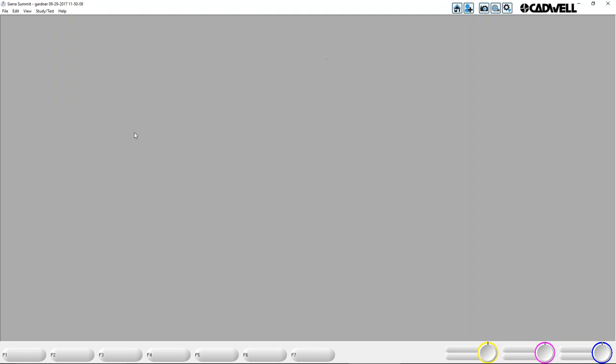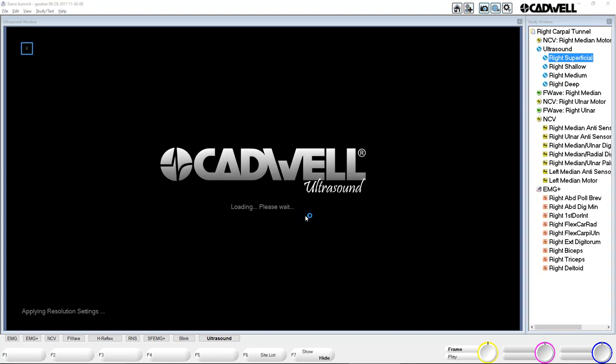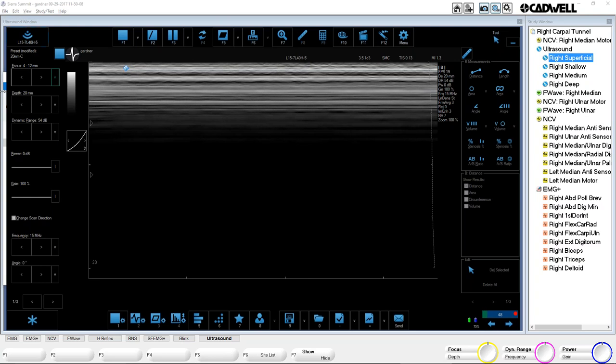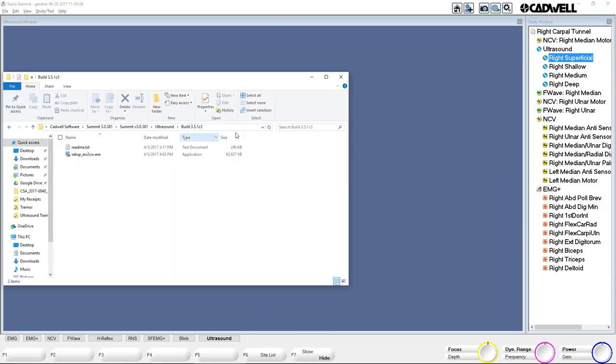I'm going to jump right into the ultrasound software. I'm already in a patient, so I'll select a study here. The first time you select ultrasound, it does need to load — once it's loaded, it'll pop right up. They can switch back and forth between ultrasound and something else really quickly; the first time around it needs to load. Because I have the resolution set for Auto, it's taking up as much space as I'm giving it in this blue window.